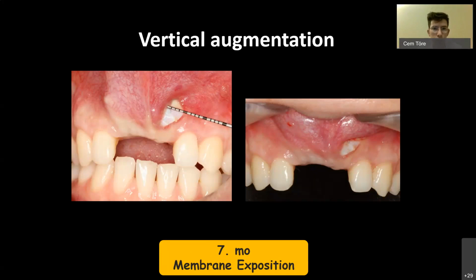If you see this for the first time, and if you have not listened to this webinar, you might be tempted to go, oh, I will just put a suture in one end and on the other, and I will close it. Any attempt to close this exposition will just make it bigger and wider. A word of warning.